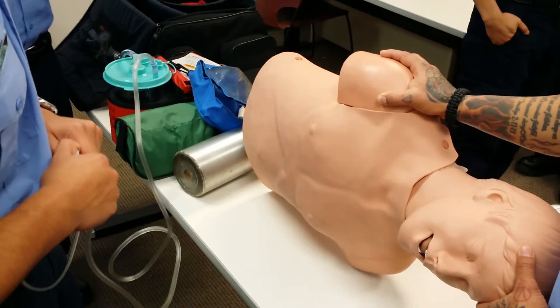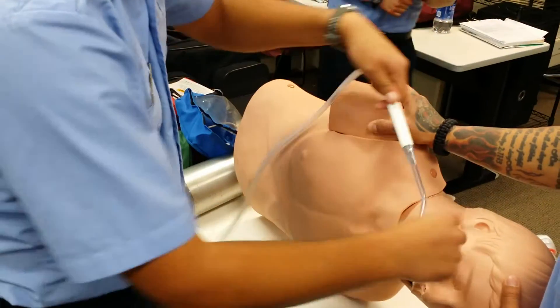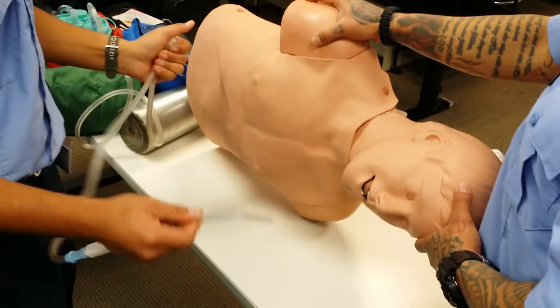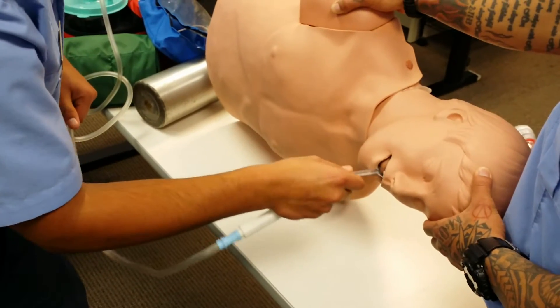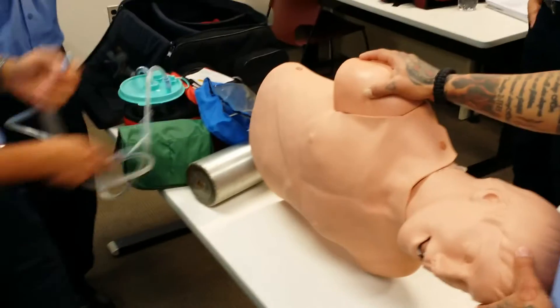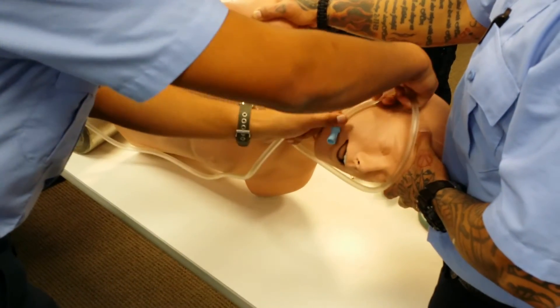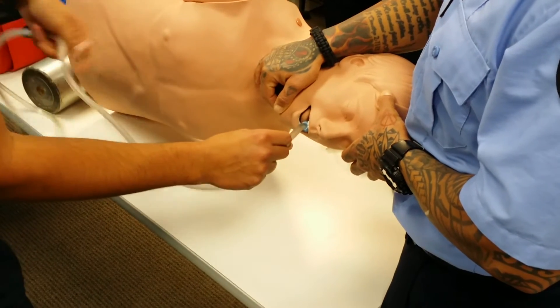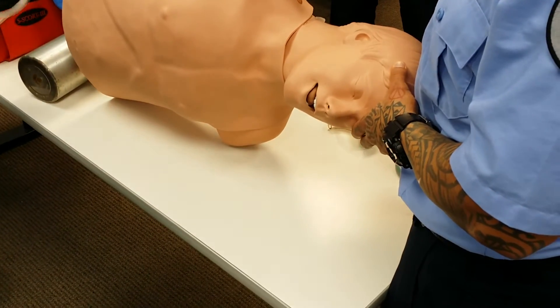Now it seems like a thicker substance, so I'm going to go to my rigid tip — Tonsil tip, big stick, whatever you want to call it. First I'm going to size it, going to want to kink it — suction out, not in. Placing it at the bottom of the cheek, start suctioning 10 to 15 seconds in a circular motion. Still vomit, getting thicker. Now I'm going to go to my universal tubing — kink, size, place inside at the bottom of the cheek, circular motion 10 to 15 seconds, let go of the kink, suction. Kink and remove. No more vomit.